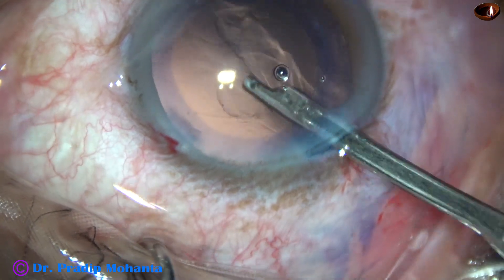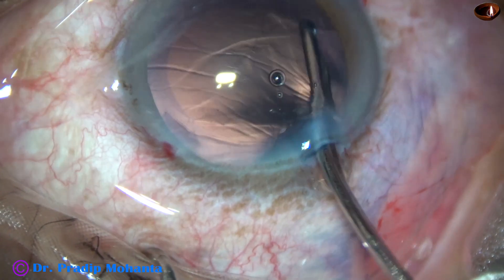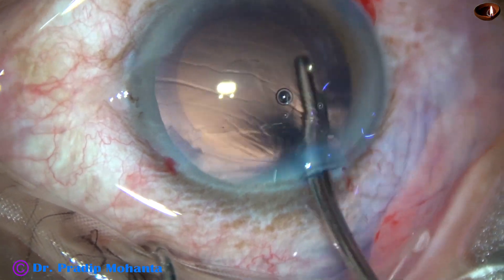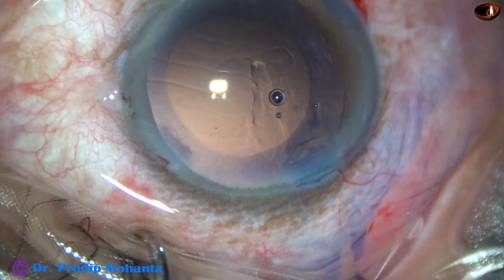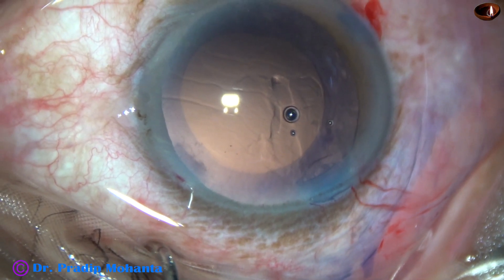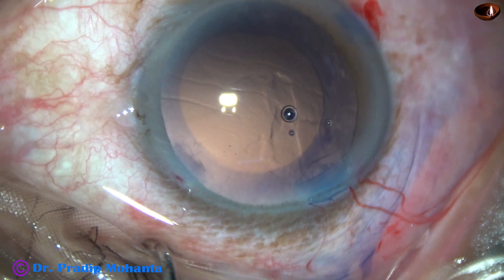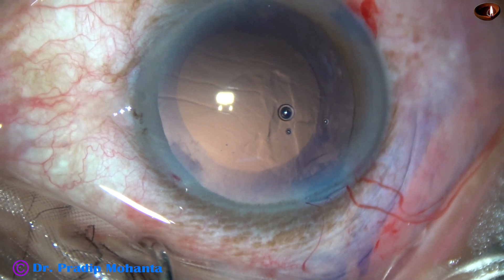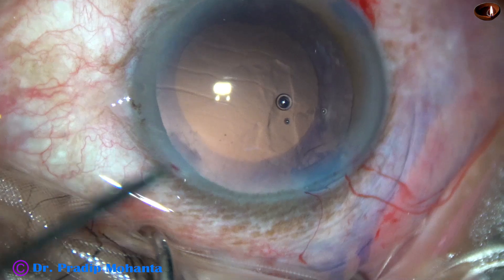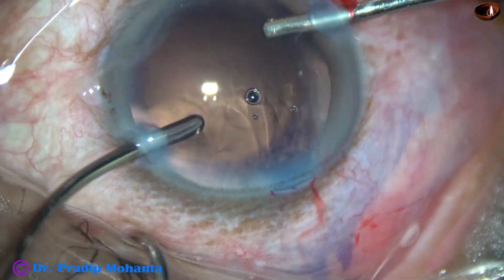And now, this is the cortical aspiration from the inferior aspect. By this time, the bimanual irrigation-aspiration is ready. So, I am going to use the bimanual irrigation-aspiration for removal of cortex from the upper part.